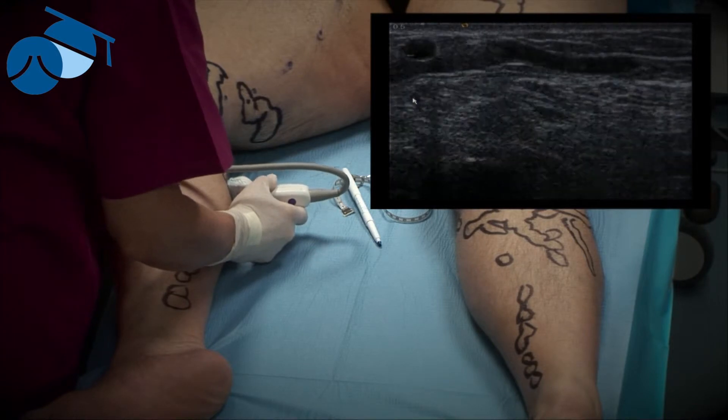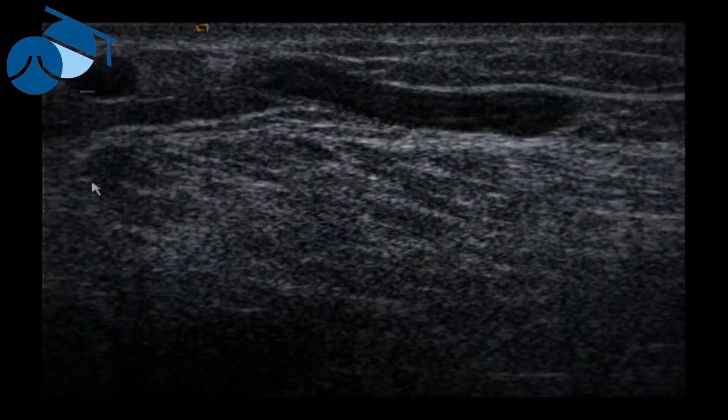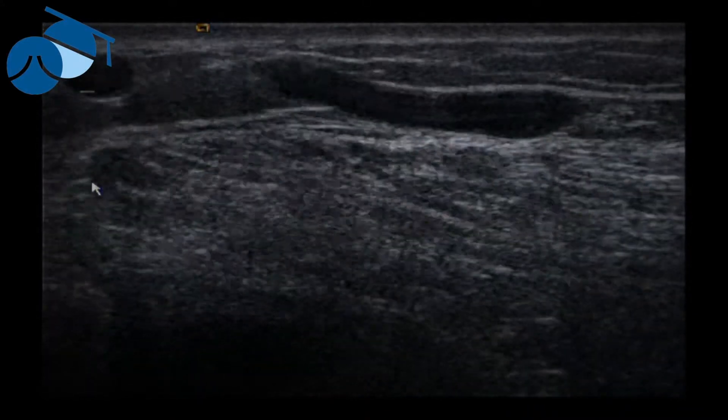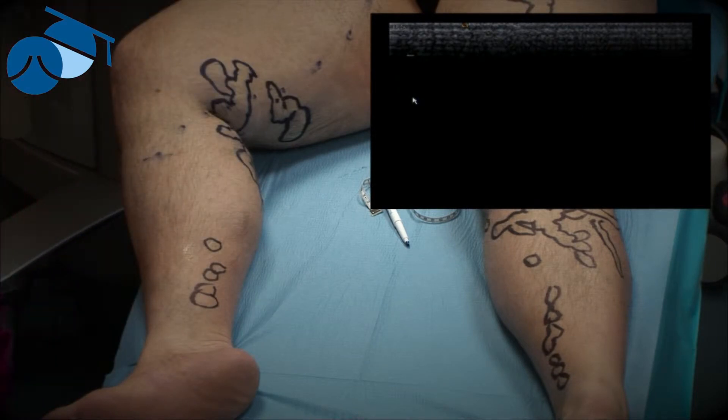We then use the ultrasound in the area and we can find it, as seen here, as a large incompetent perforator. It's coming from the muscle through the fascia and out towards the surface in the skin.